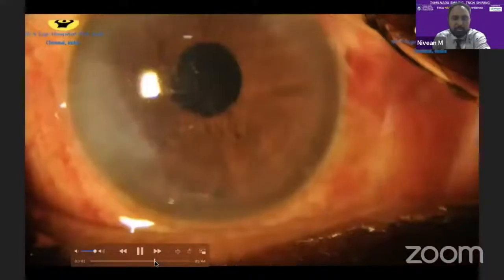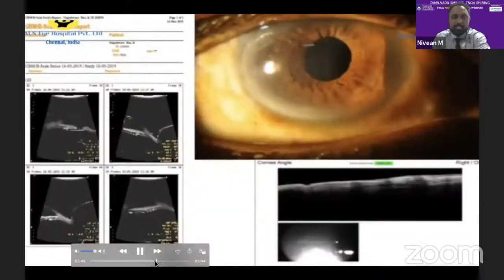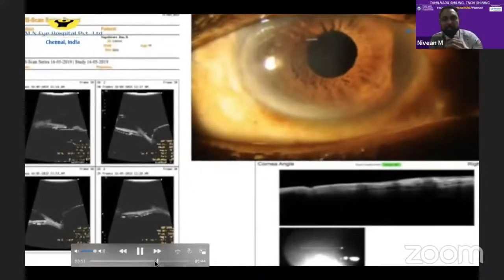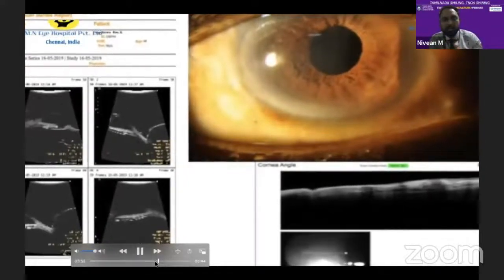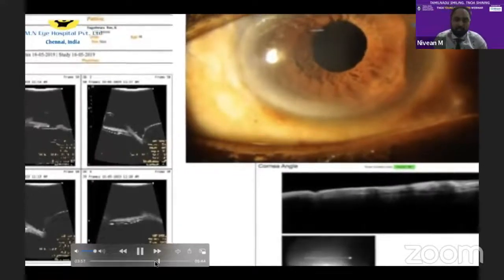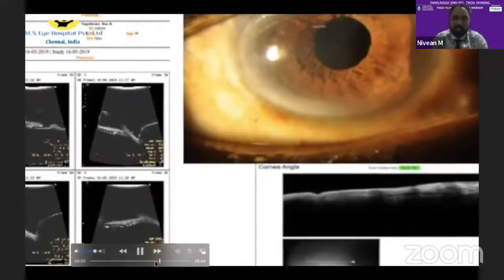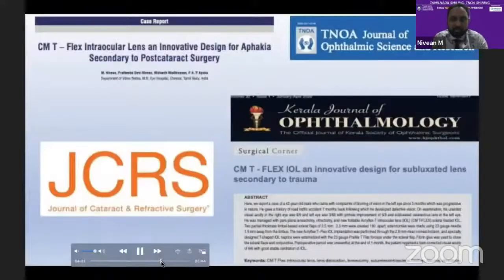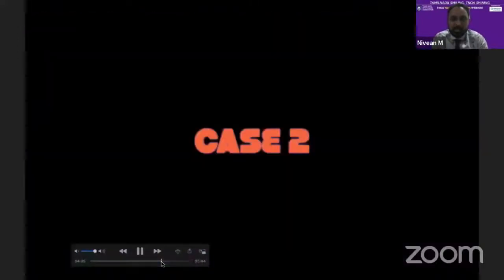So these are some of the post-op immediate results. As you can see, day one, well-centered IOL, round pupils, because these lenses have an angulation also. So the UBM pictures in the study show that there's no rubbing against iris or pigment release or any glaucoma that is induced because of the lens. And also some studies of OCT on how the scleral flap behaves under the IOL. So we have publications that have gone, and another 2 publications are in progress right now.